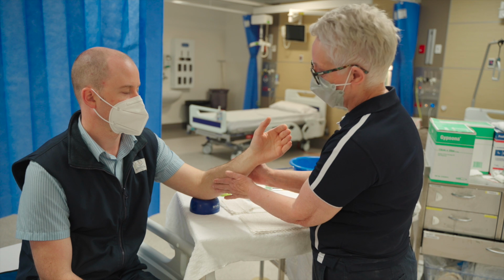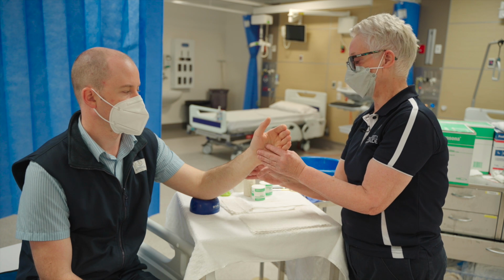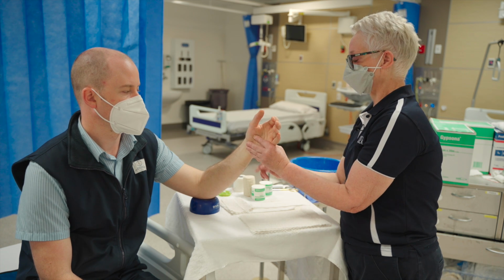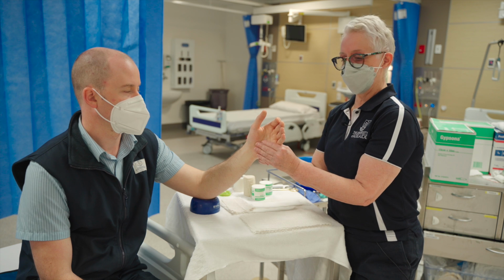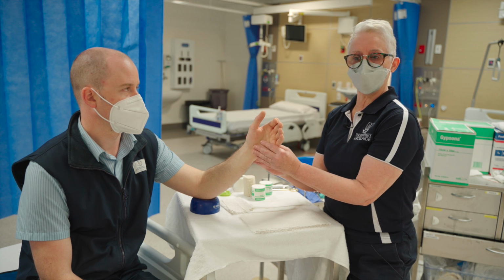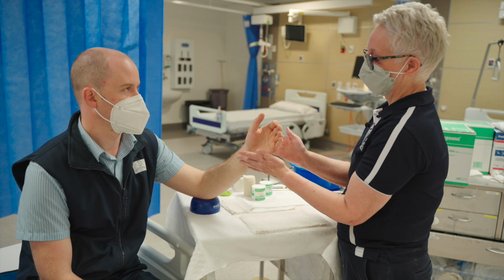So what we're looking for next is actually any skin integrity that may have been broken. So we're looking for any wounds that may be there, any K-wires that may be sticking out, or any bony prominences once you put an arm into position. The next thing we're looking for is to make sure that there are no IV lines, no tags, nothing in there that would actually protrude into the cast and cause issues.